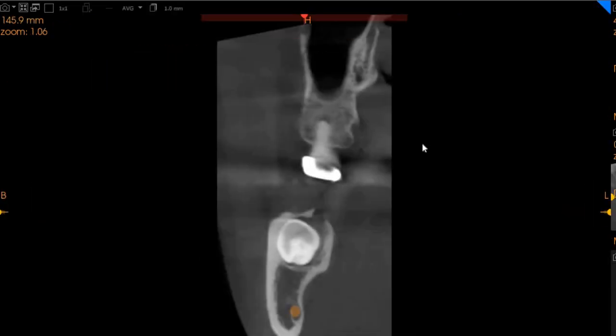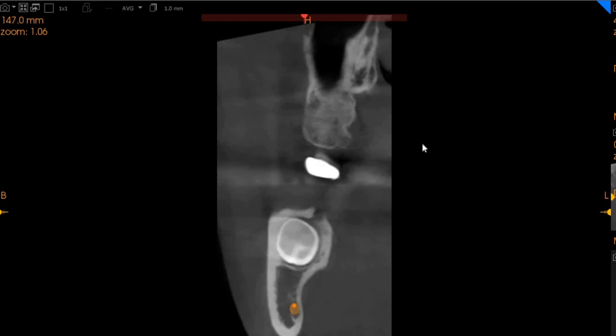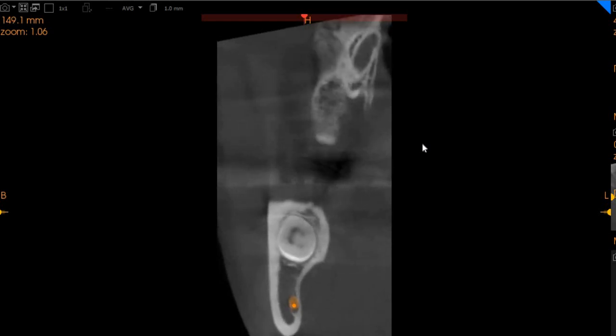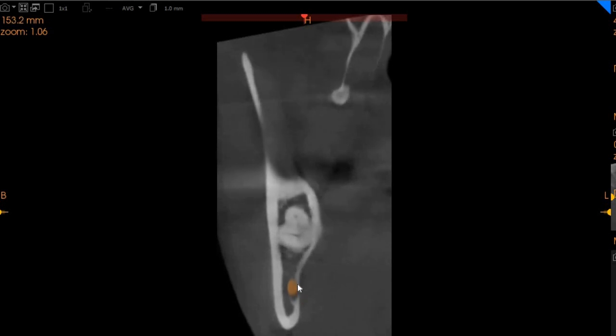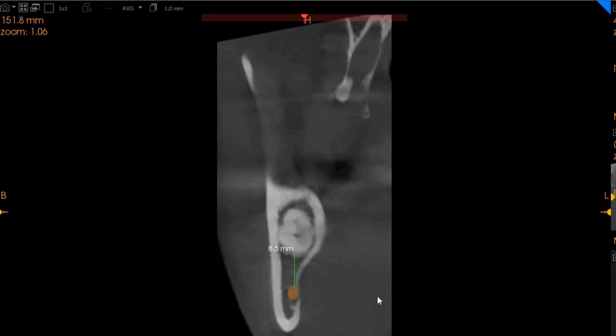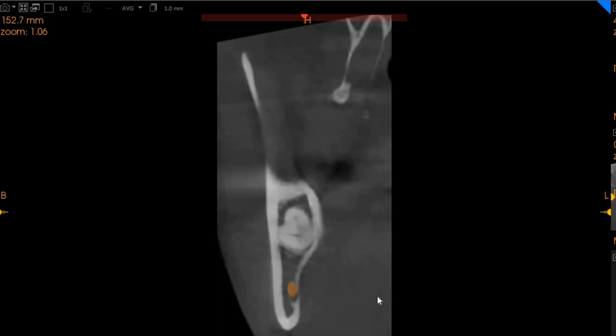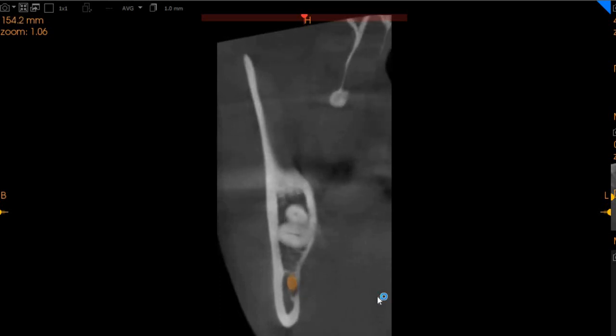This is the transaxial view, which is basically the proximal view. On the transaxial view, you can see that it is horizontally impacted. We've got complete cortical coverage of the wisdom tooth crown. And as we are moving distally, you will be able to see that the inferior alveolar nerve is placed quite inferior to the wisdom tooth on the lower left side of the mandible. We've got approximately 8mm of distance between the inferior alveolar nerve canal and the wisdom tooth which is impacted.